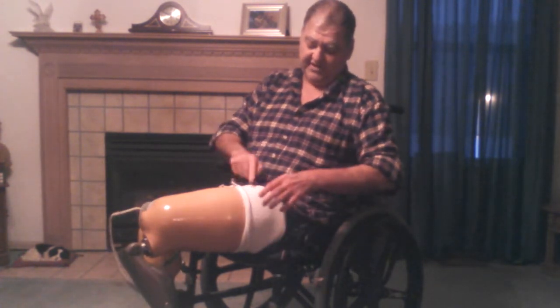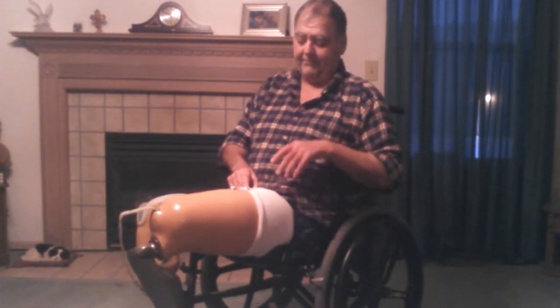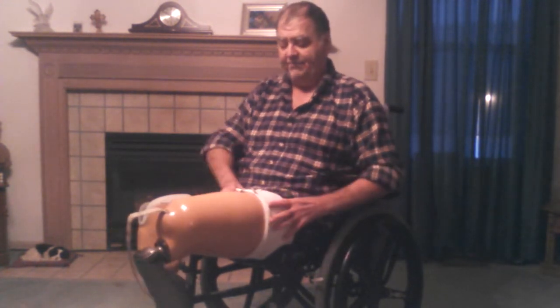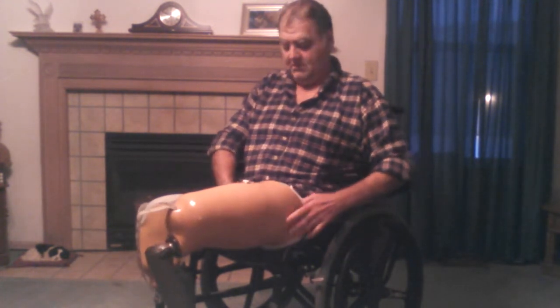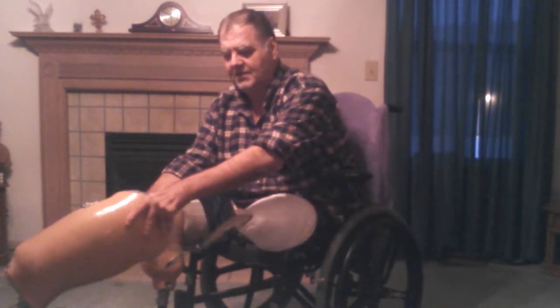There's extra padding because of the socks around this edge, so it makes that more comfortable. I've pulled this leg about four or five inches off at this point. I want to pull these liners off and then pull this leg off separately.